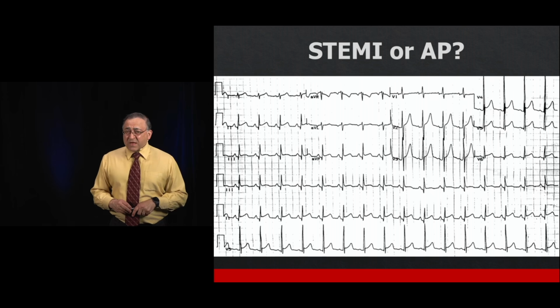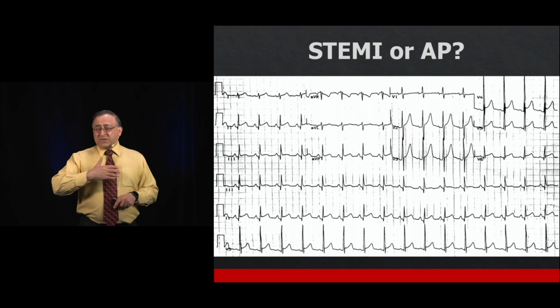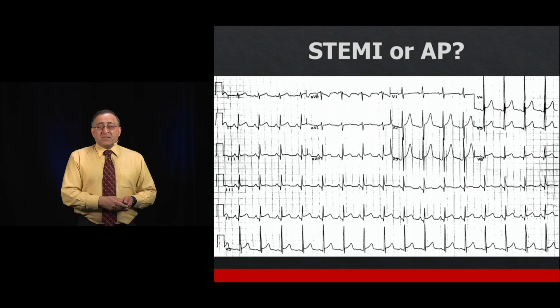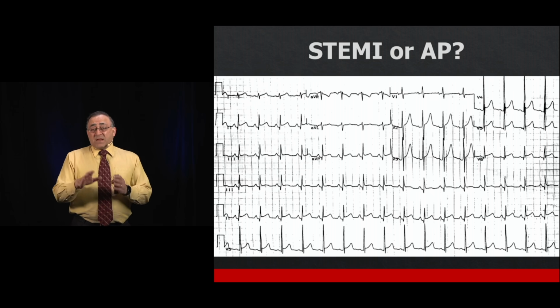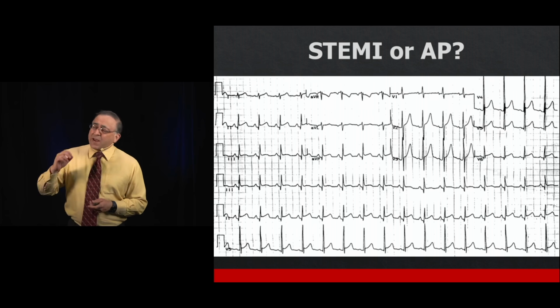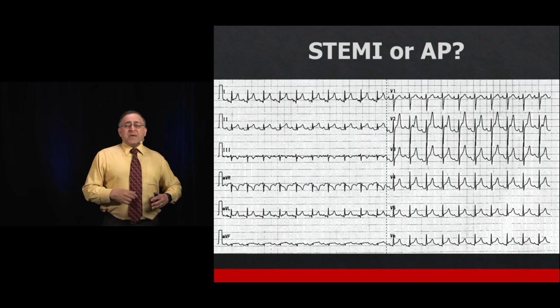Fortunately, the patient survived. And then about 45 minutes afterwards, after the patient went up to the OR, they found an old EKG and discovered that these Q waves were actually old. And so, again, that's why I emphasize be careful about relying on Q waves unless you absolutely know that they're new.